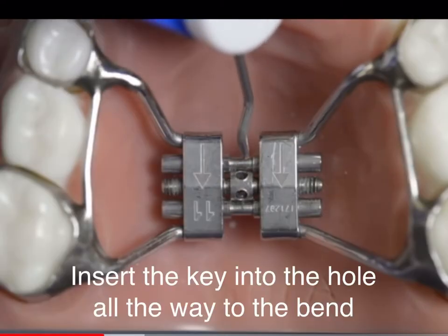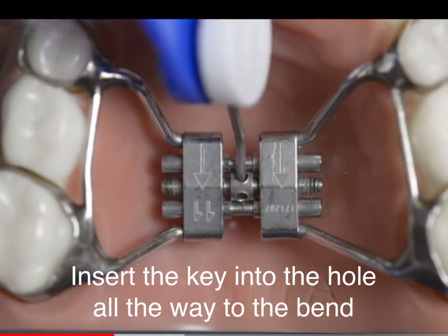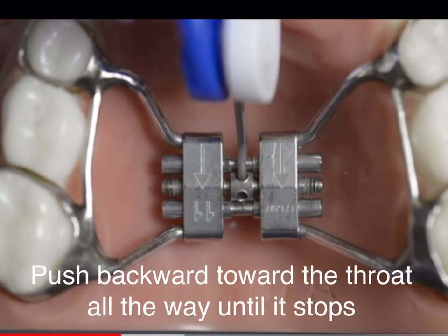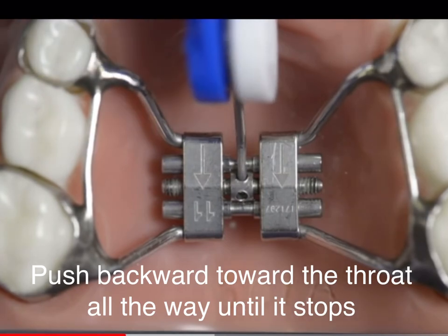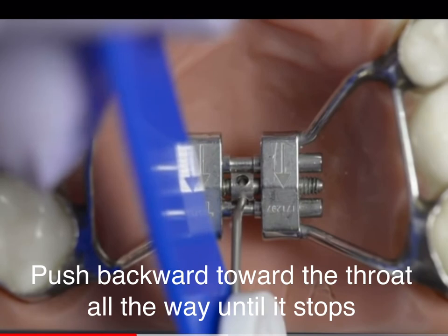Forward position — this is the hole towards the front of the mouth. Go ahead and slide the key into the hole until you feel it hit that safety bend. Then you're going to push back towards the back of the mouth until you see the next hole rotate around into that forward position.